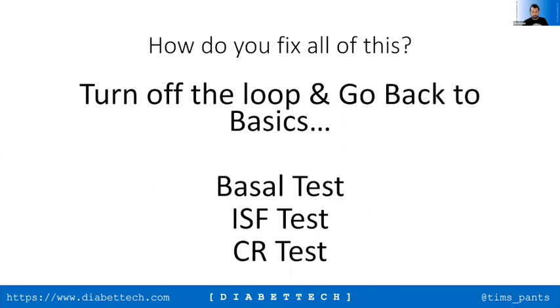But it's not really a case of is it or isn't it working in a very clearly defined set of questions. It's ultimately about whether you as a user are getting out of the system what you want to. And if you are, then you are perfectly able to carry on using it as you do. If you want to do something different, if you've decided that you want to get a higher time in range, for example, lower time below 3.9, lower time above 10, that's really your call to make.